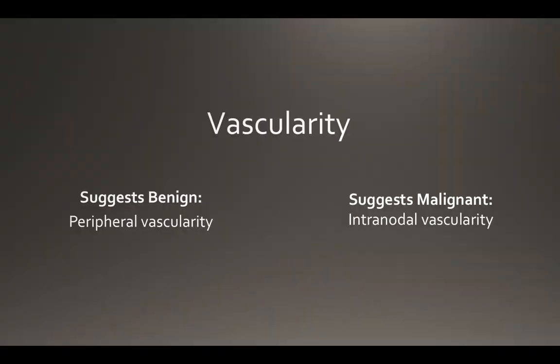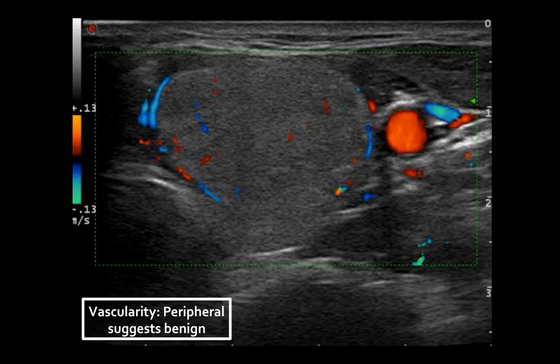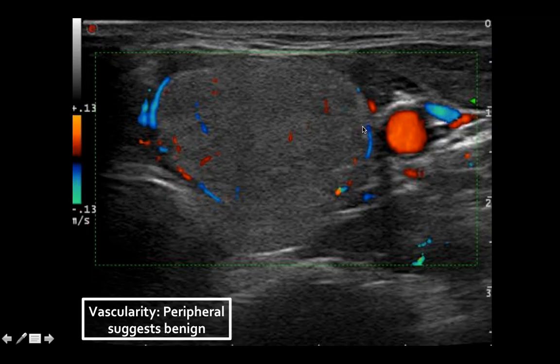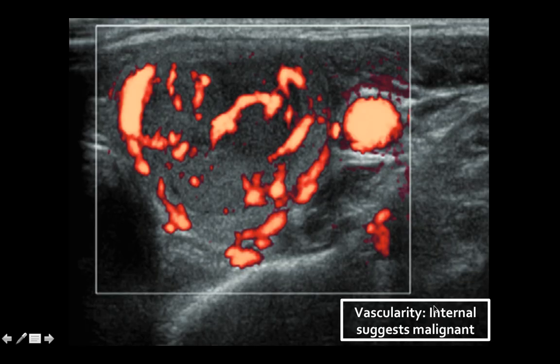Finally, we'll discuss vascularity. A peripheral pattern of vascularity suggests a benign lesion, whereas an internal or intranodal pattern is suspicious for a malignant nodule. You can visualize vascularity by using the color or power Doppler settings on the ultrasound machine. Here's a nodule with color Doppler — we see the carotid and internal jugular vein lighting up laterally, but the node itself has very little internal vascularity. The majority is concentrated around the periphery, suggesting a benign lesion. Here with power flow Doppler we see a much more internal pattern of vascularity, with vessels penetrating throughout — a pattern concerning for malignancy.